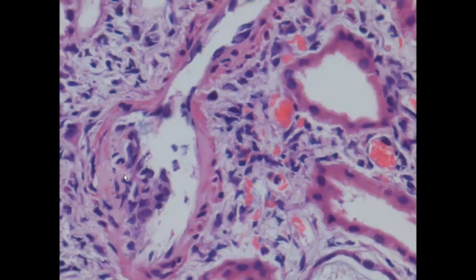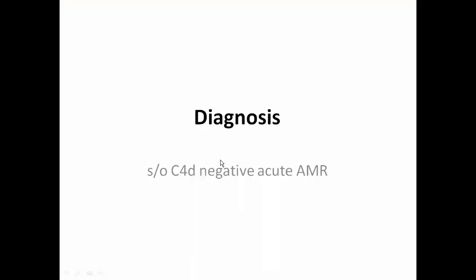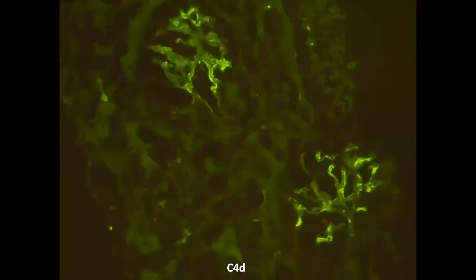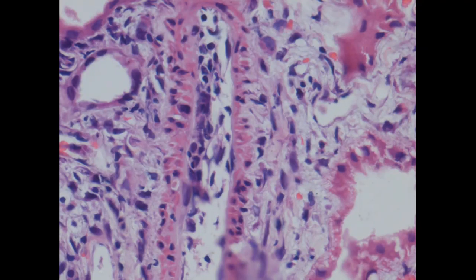But the important thing is, you can see these lymphocytes which are causing lifting of the endothelium. So there is evidence of endothelitis. So presence of endothelitis with microvascular inflammation in the form of PTC capillaritis, glomerulitis, and not one vessel. There were two vessels which are showing this endothelitis. And if you look here, if you see the luminal circumference, more than 25% of the luminal circumference is showing endothelitis. So that means it becomes a 2B.